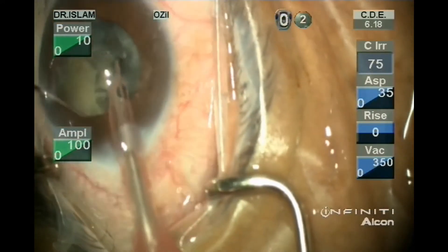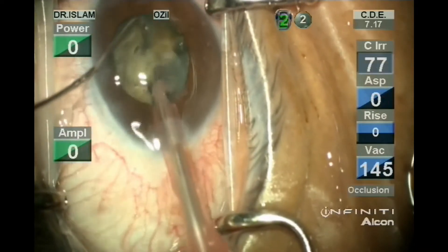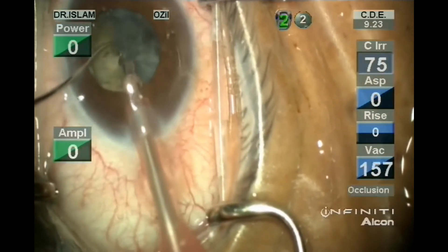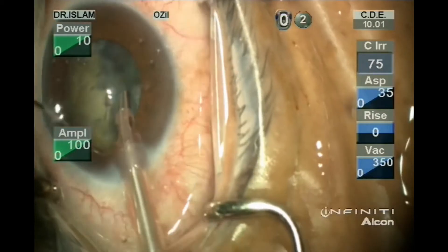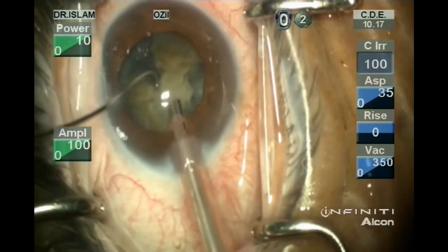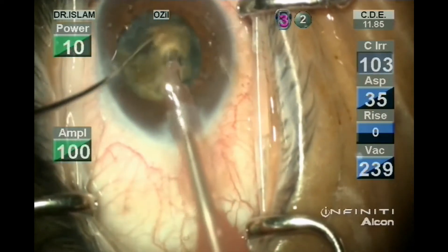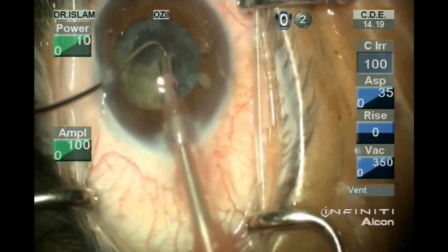Then the Infinity machine: the vacuum is 350, torsional 100 and the amplitude of the torsional is also 100. As you can see, the CDE is increasing dramatically in the Infinity machine more than the Centurion machine. And there is a surge with the Infinity machine which was not evident in the Centurion machine.